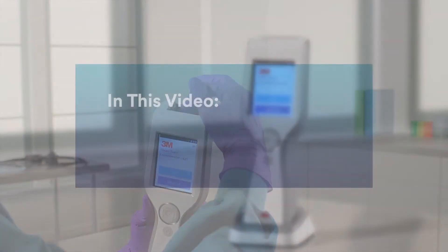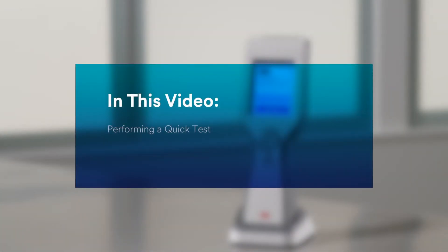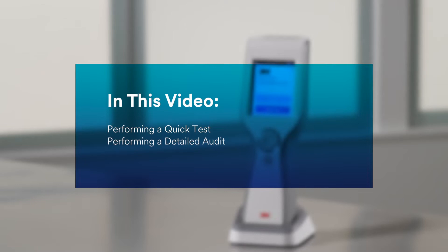Today we'll cover three key topics: performing a quick test, performing a detailed audit, and retesting a failed audit.